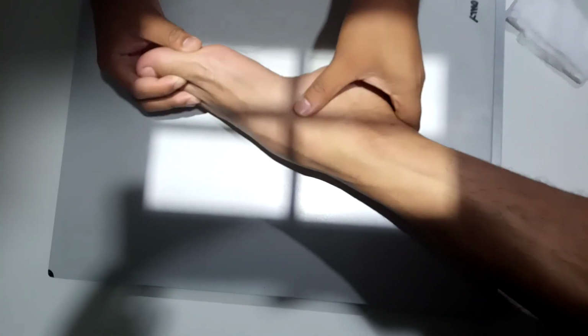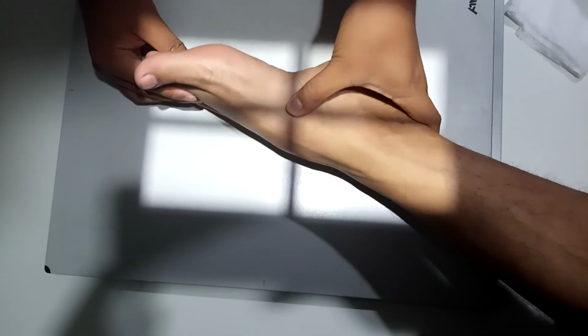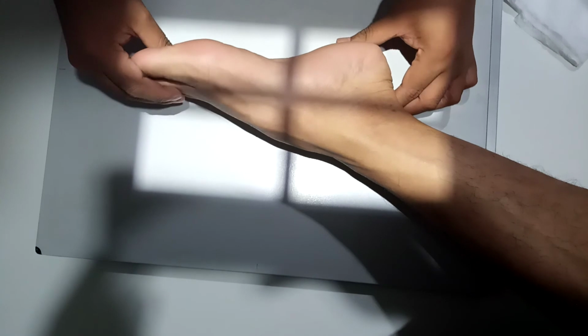The SID that we are going to use is 40 to 44 inches or 102 to 113 centimeters. For collimation, remember that you must collimate on the four side margins of the foot and ensure to include the distal ankle. And that would be all.